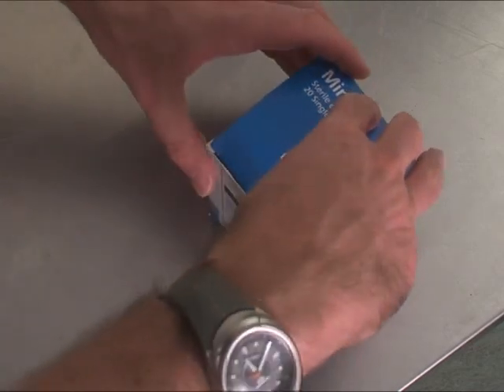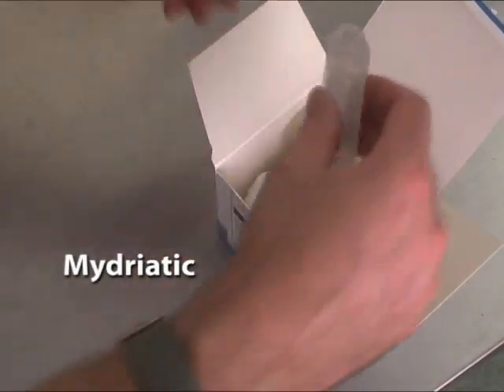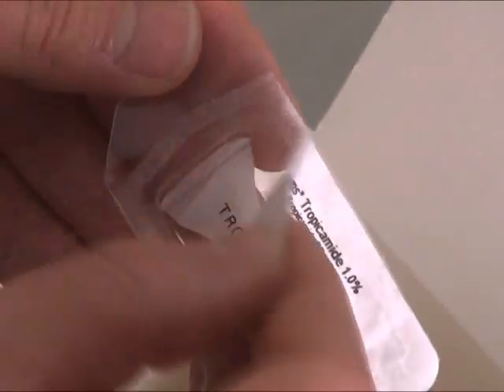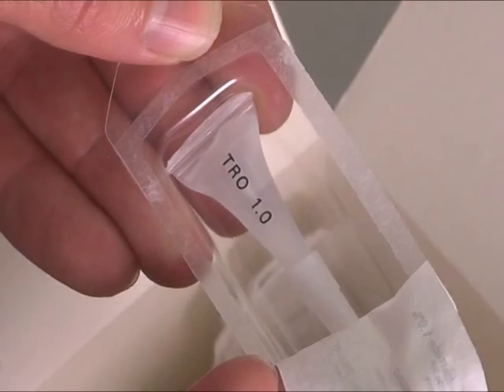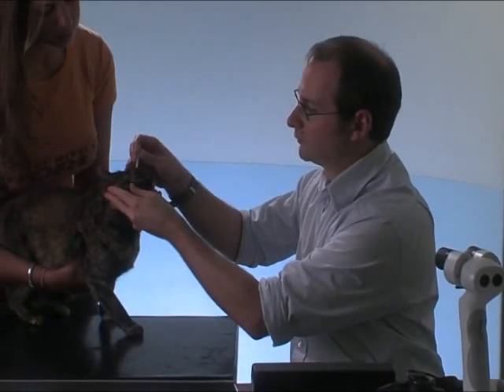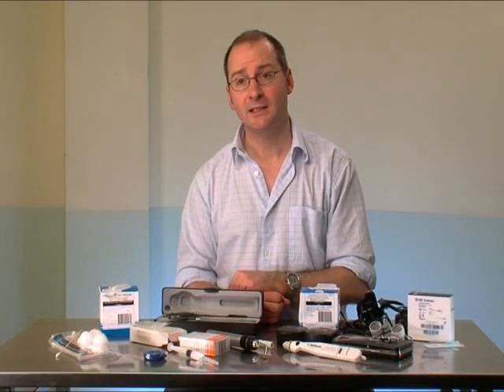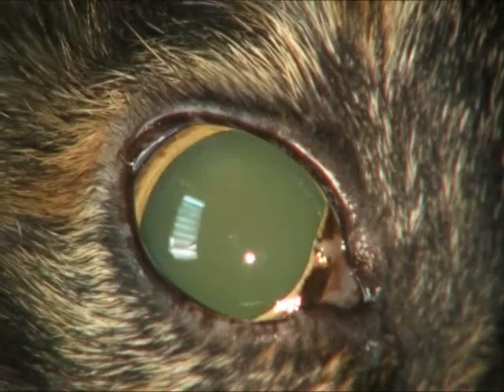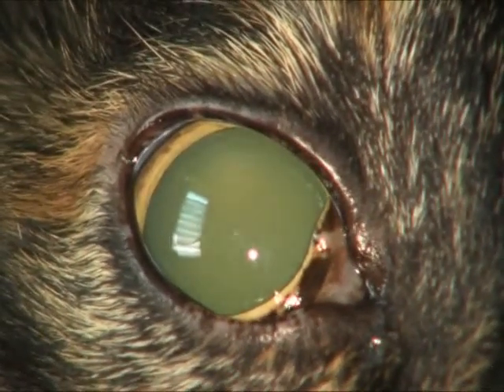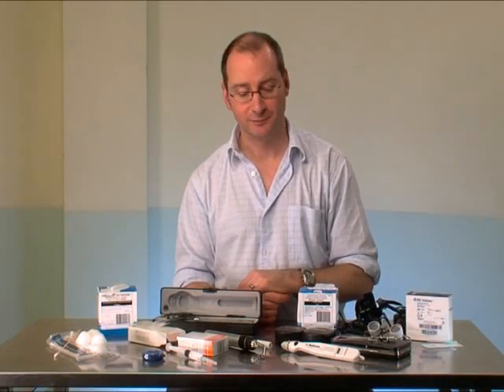To facilitate ophthalmoscopy, it is often necessary to dilate the pupil using an appropriate mydriatic, such as tropicamide. Tropicamide is an atropine-like agent and is short-acting, so it will dilate the pupil, but it will only last for 1 or a couple of hours, as opposed to atropine, which particularly in cats can last up to a week in a normal eye. In fact, I've had animals referred because their pupils weren't responding a week after having atropine.